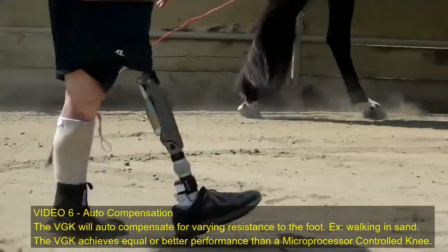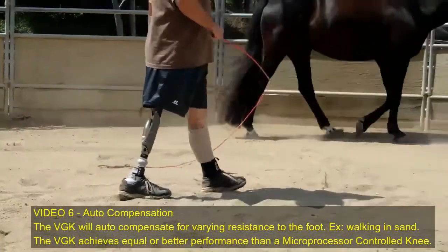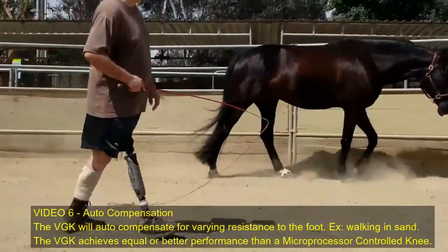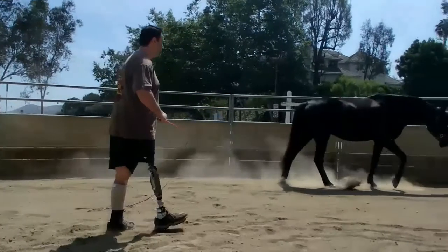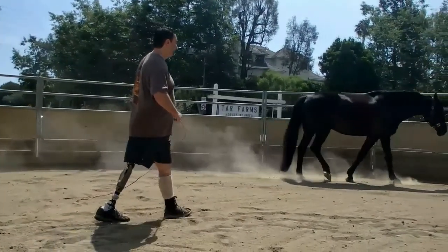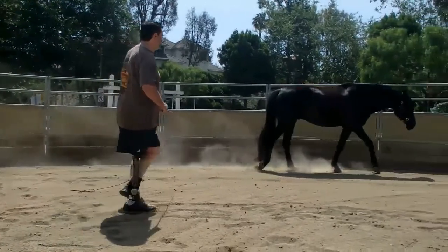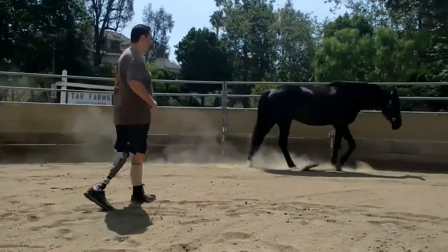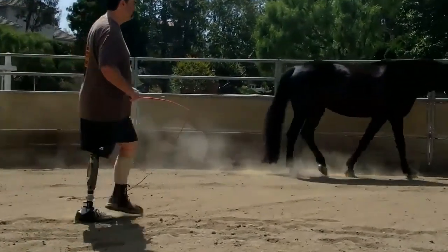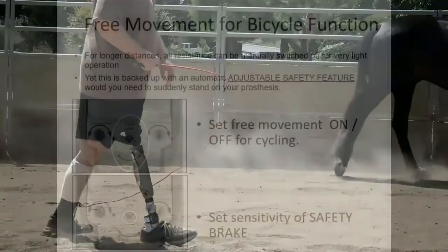It always works the same. Now, one of the interesting features that happens during swing phase is that this knee will compensate for the weight of the foot or whatever is driving the leg forward. So, for instance, if you're walking in mud, your shoe gets full of mud, it weighs more, it swings differently. So if you pay attention to this video, you'll see this guy literally drags his foot through the dust and it doesn't matter. It still gives him the swing that he's looking for.